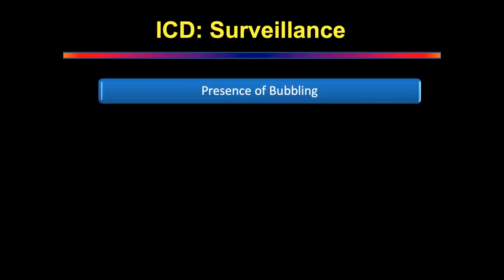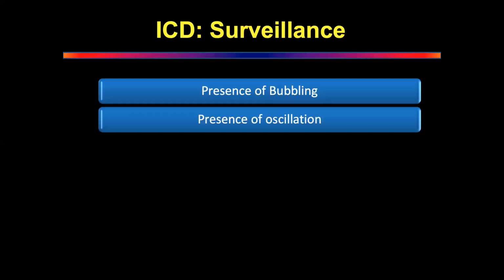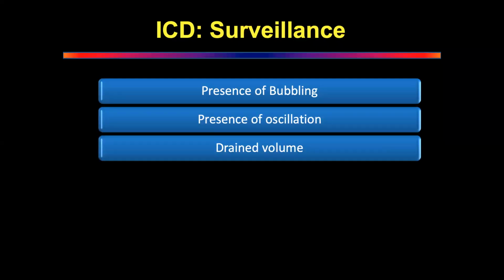Okay, good. Presence. Good. Keep talking. I'm happy with everything you're saying. What else? Nature of fluid. Okay. Nature of fluid in the tubing rather than in a bag. Okay. What else? Then chest X-ray.